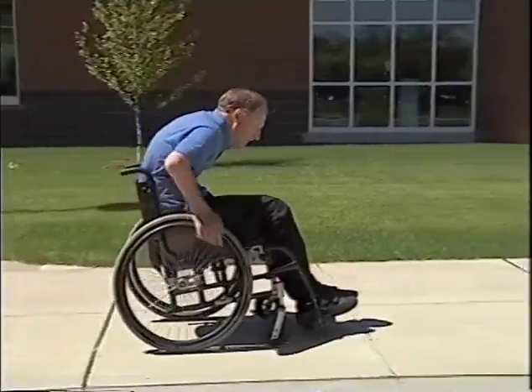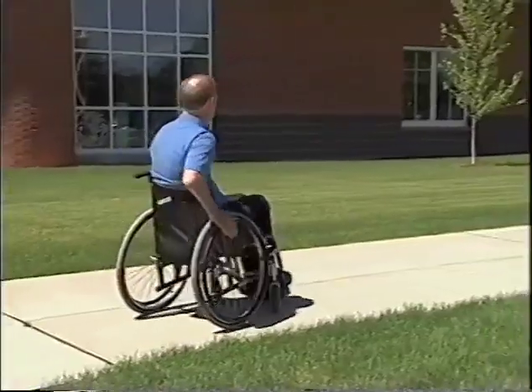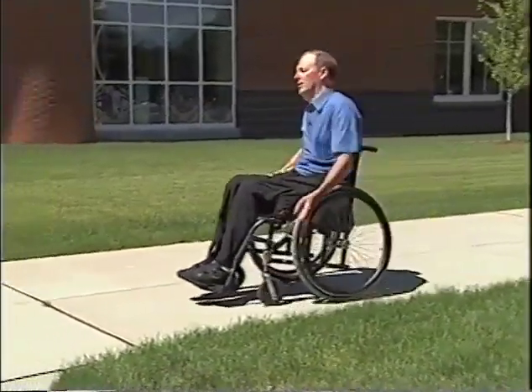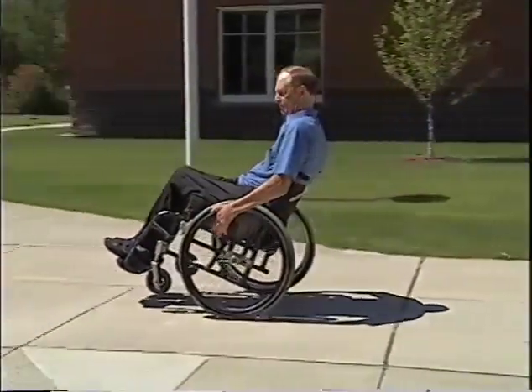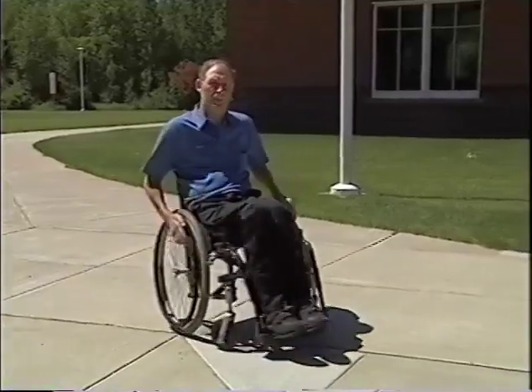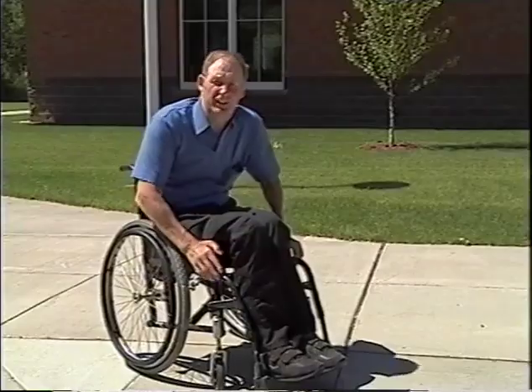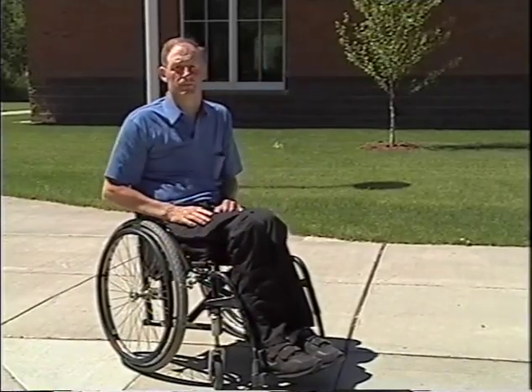So your weight is back and you're picking the chair up and going over the curb. So you can be moving along, boom, boom. Once you teach that many times, then they'll get their timing down, and the next thing they can go on to is jumping over a curb.